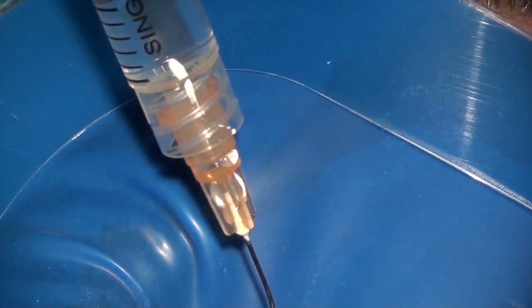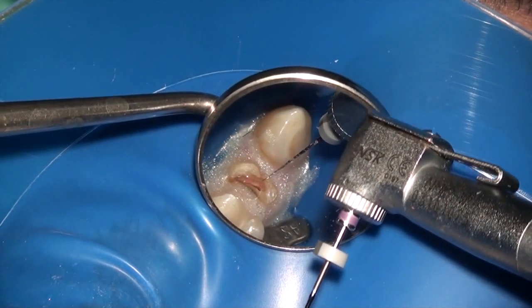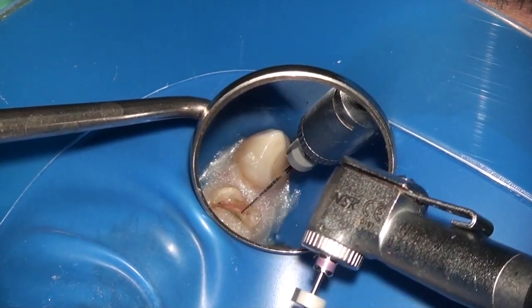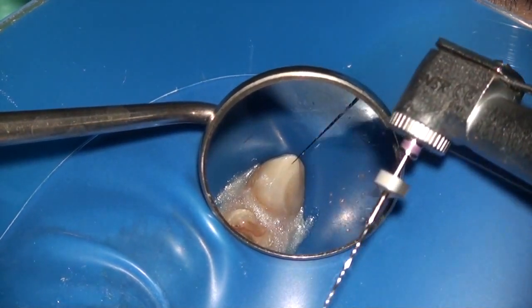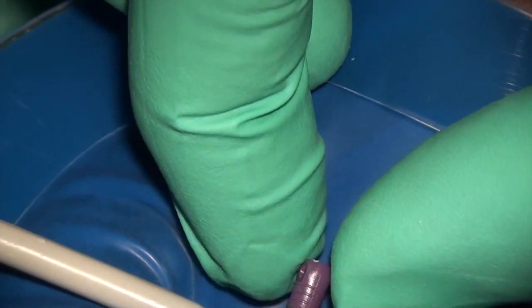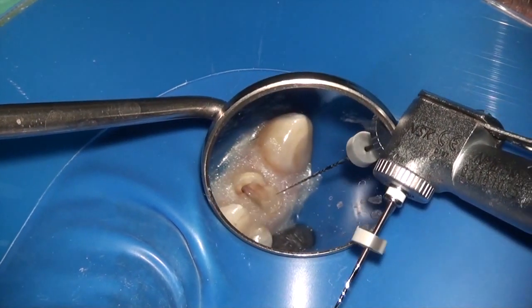After using the 10.06 and 10.04, I'm now putting a little bit of EDTA in the chamber and moving to the size 10.02 file. After taking my 10.02 to length, I measure the working length. Once I have determined the working length, I take my size 15.02 Scout Race File up to that length in each canal.